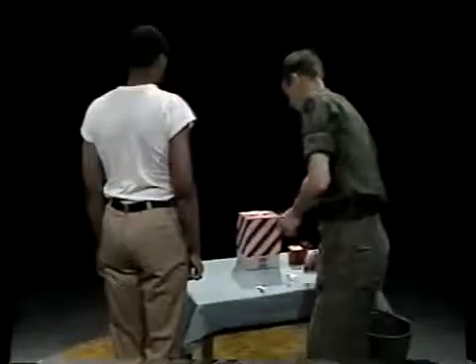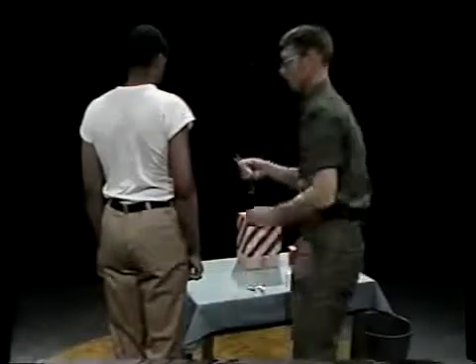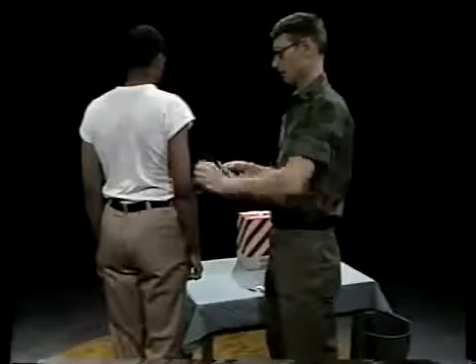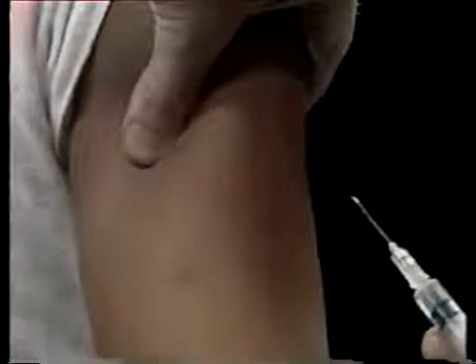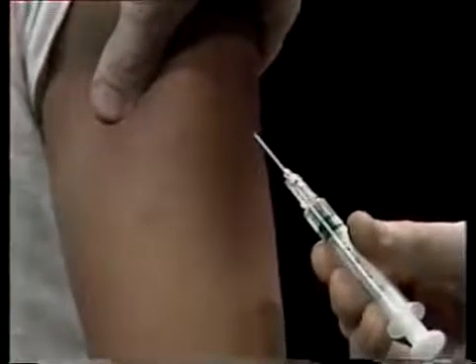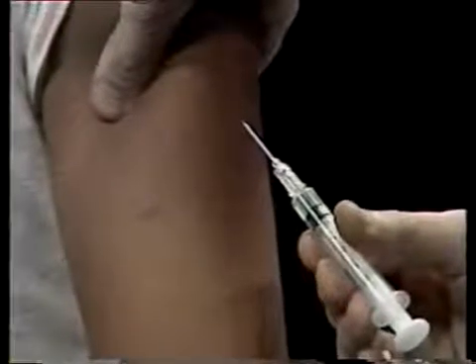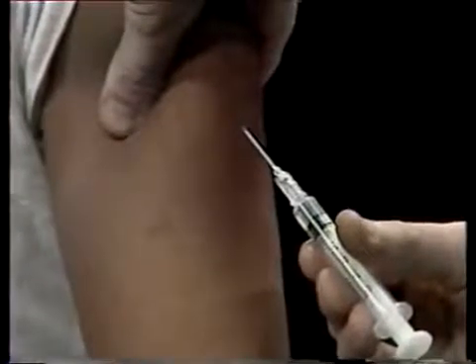Now pick up the syringe and remove the needle guard — pull it straight off, don't touch the guard to the needle. With your other hand, pinch the skin of your patient's arm and hold it firm. Hold the barrel of the syringe with your right hand between your thumb and index finger. Check to see that the cutting edge or bevel of the needle is pointing up toward you. Move the needle up toward the cushion of skin you're pinching and hold the needle at about a 45-degree angle upwards.